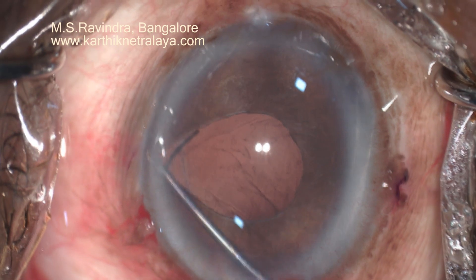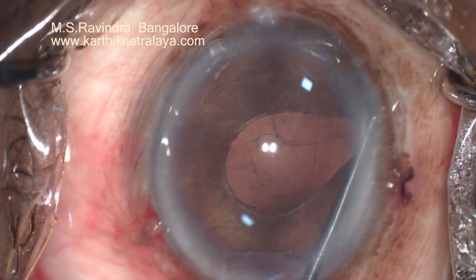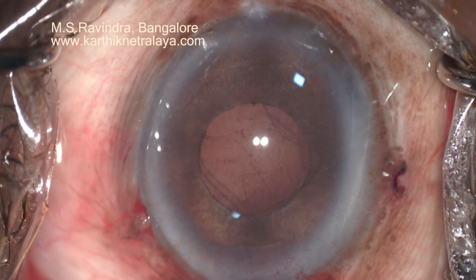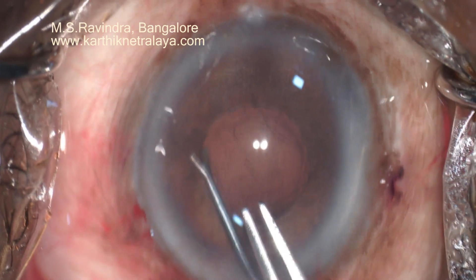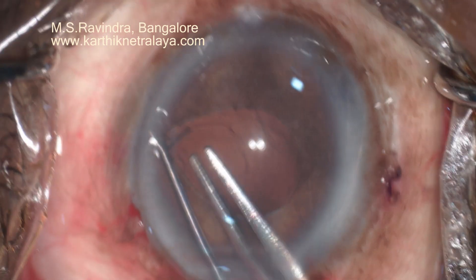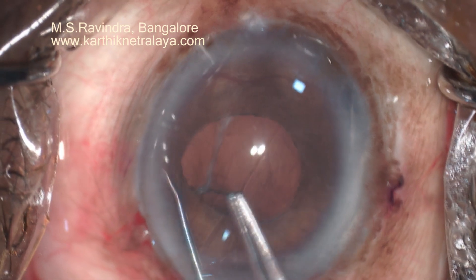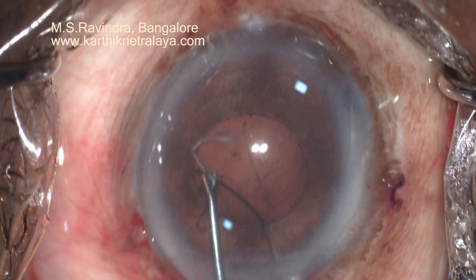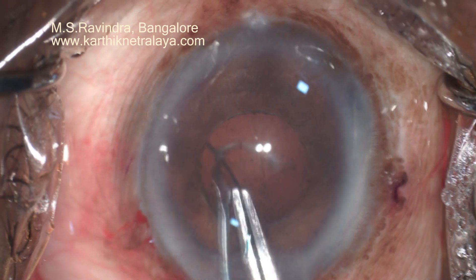On wide-angle exploration of the non-dilating pupil, the haptic was found in the inferior retroiris space. It was extracted using a forceps. Remnants of capsule were seen. There is no vitreous prolapse or hyaloidal face disturbance. The remnant was removed along with the haptic.